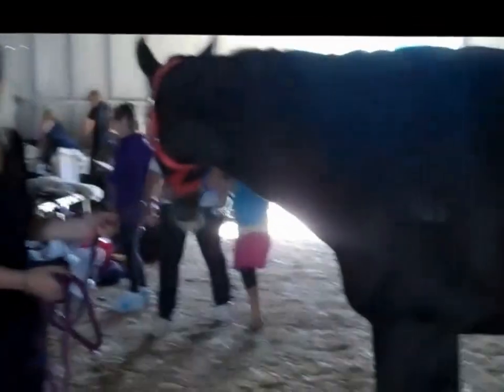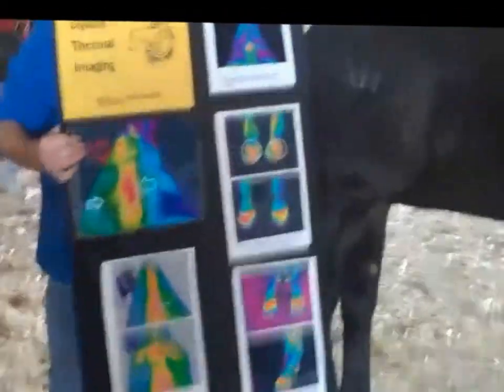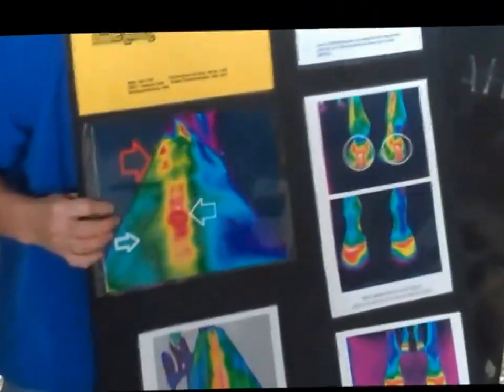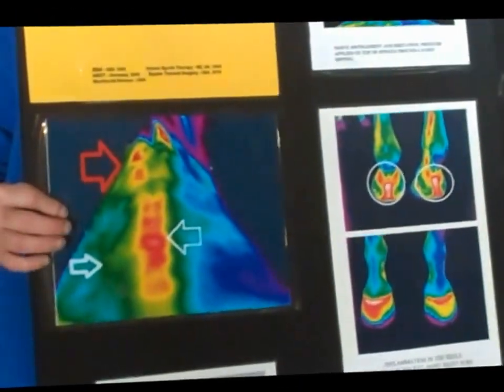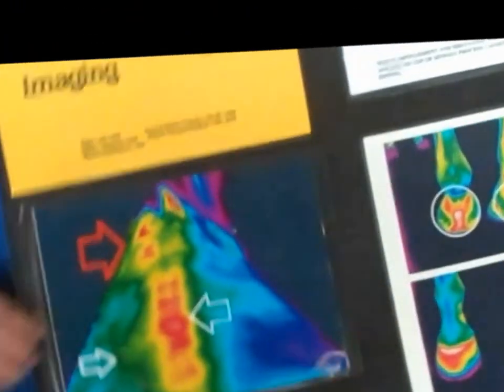Here are some of the images I've taken. With the back, we can actually look at it and see the different patterns. This particular shot here is a pony that we'd just bought, and when we got the pony he would nap and want to buck the kids off.